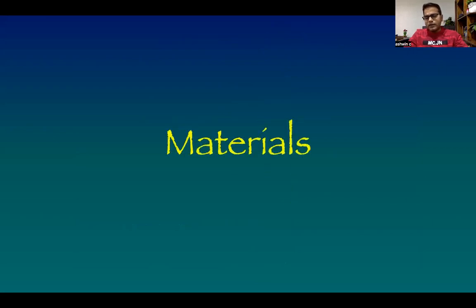So what materials are we using? We are using at least two types of instruments in endodontics. First is stainless steel, and second is nickel titanium. Now there are modifications of nickel titanium also. There are modifications of stainless steel also. But in basic instrumentation metallurgy, only two: stainless steel and nickel titanium.